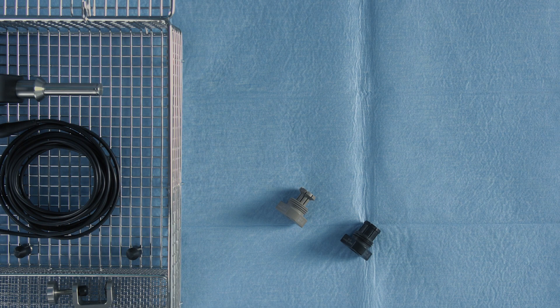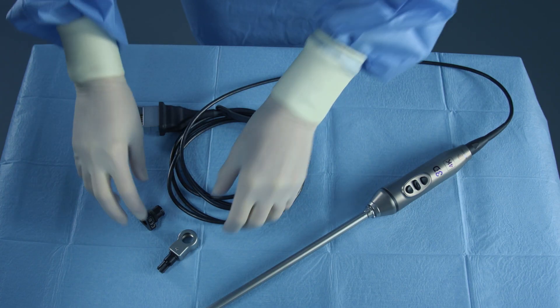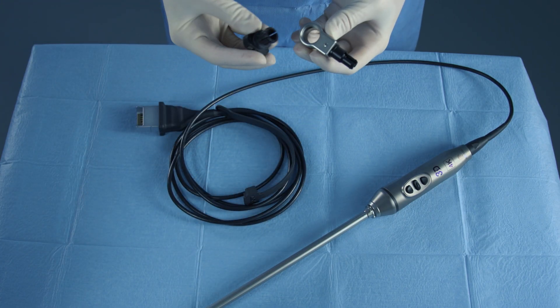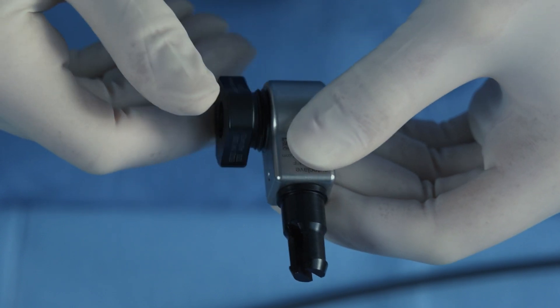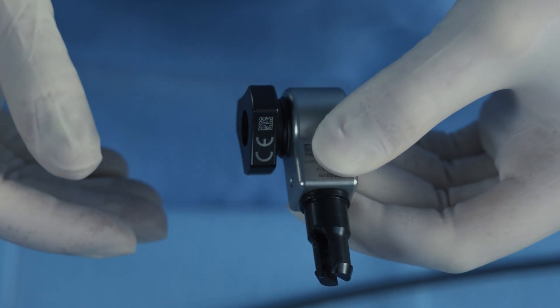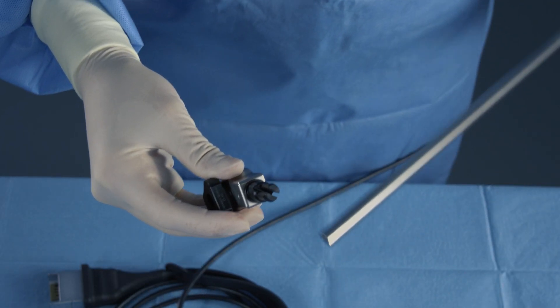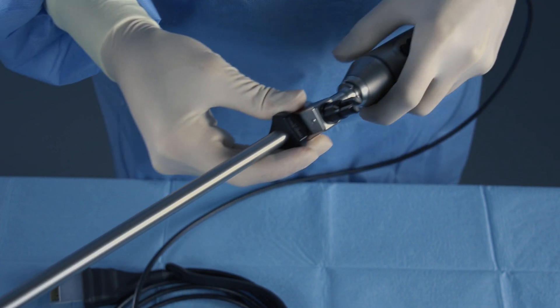Choose the tension sleeve you are going to use, 5mm or 10mm. Screw the sleeve loosely into the endoscope clamp. The tension sleeve should point toward the distal end of the scope.